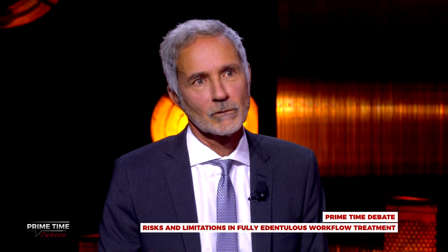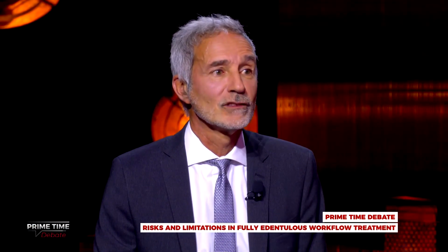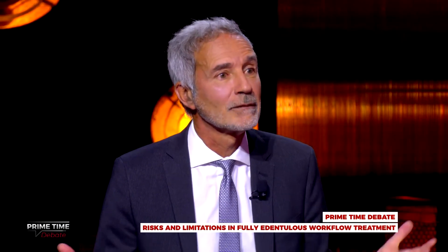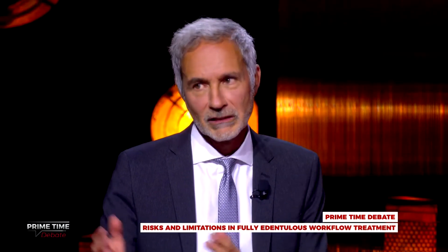For the mini screws, if I can comment, you need a very motivated patient who would like to place 3 implants before starting any diagnostic procedure, because you can also end up without any implantation because there is no bone availability. So if you have a very motivated patient, this approach is perfect.